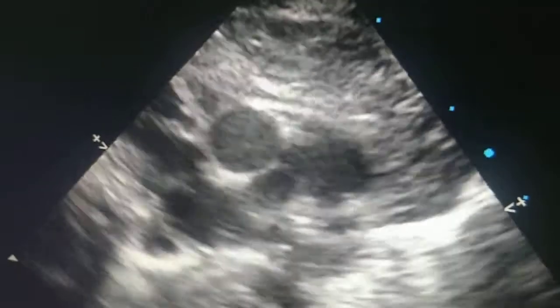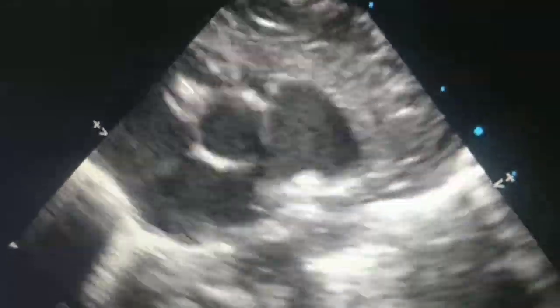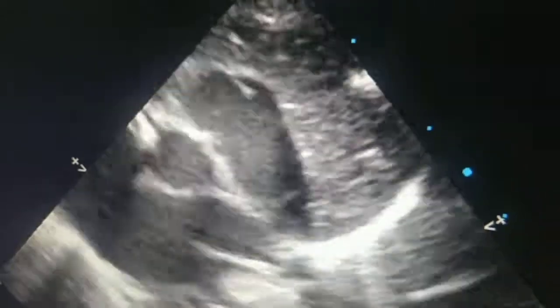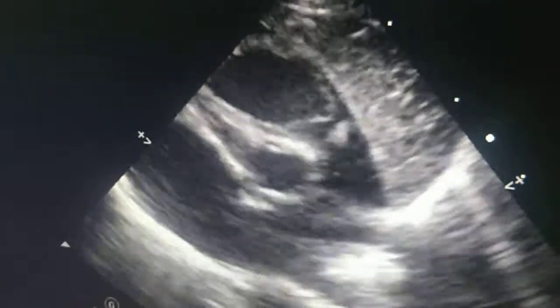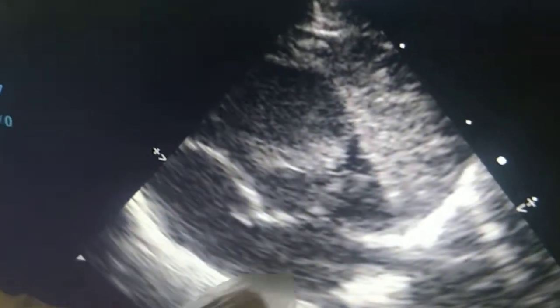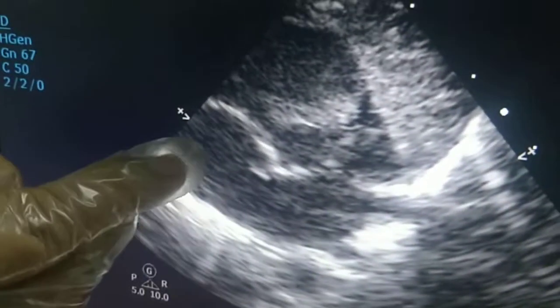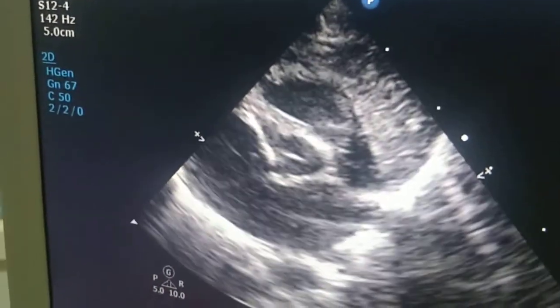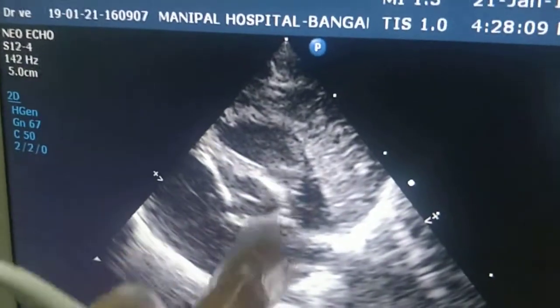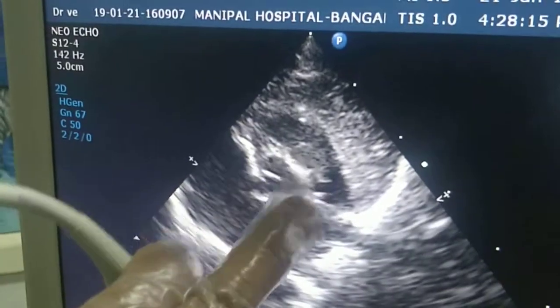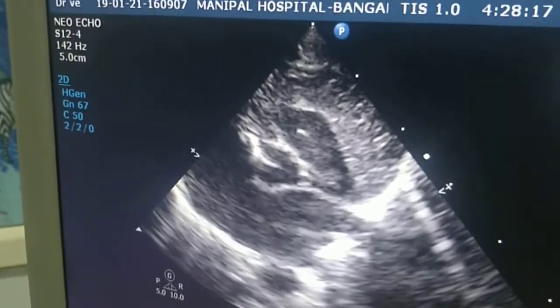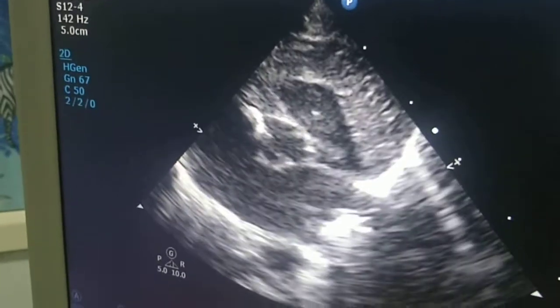This is the great vessel view. I will freeze and show you: this is the root of the aorta, you can see the left atrium, right atrium, right ventricle, and the opening of the right ventricle into the pulmonary artery and its branches — the left pulmonary artery and right pulmonary artery, visible very near to the aorta. This is your short axis great vessel view.